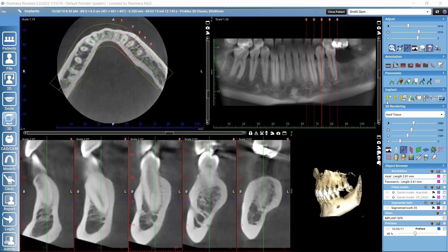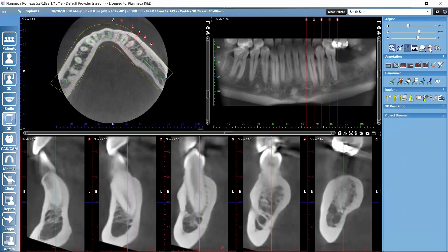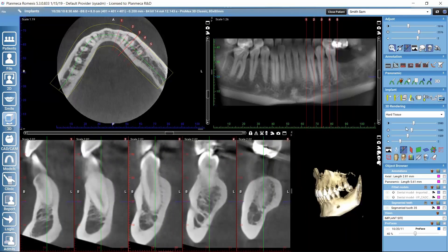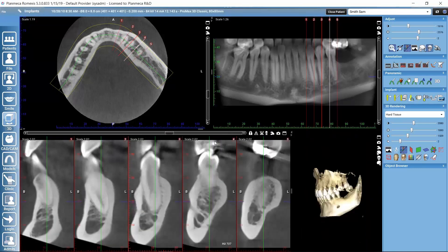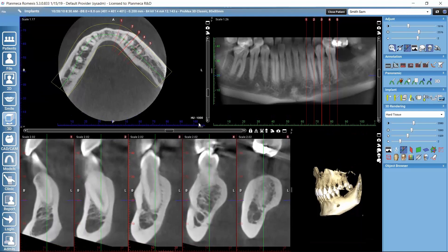I can adjust the layout a little bit — for example, I could hide the 3D rendered view simply with this 'Show/Hide Renderer' button to get more space for my cross-sections. Another option is to use the small arrows in the corner of the view to change the relative size of the two views or hide one completely. For smaller adjustments I can also use the small icons in between the views.